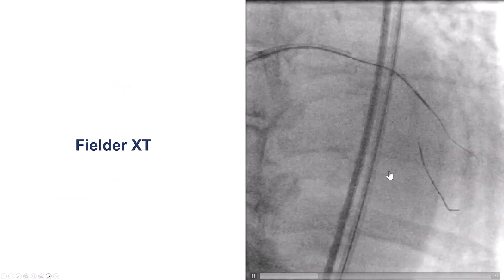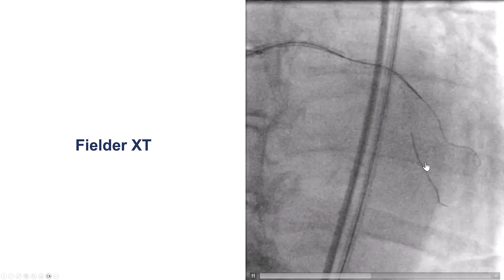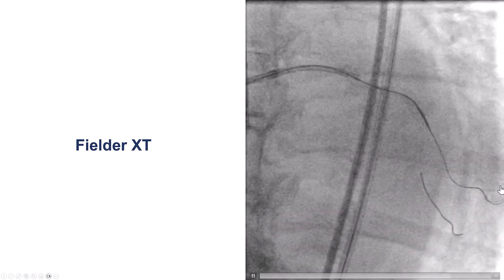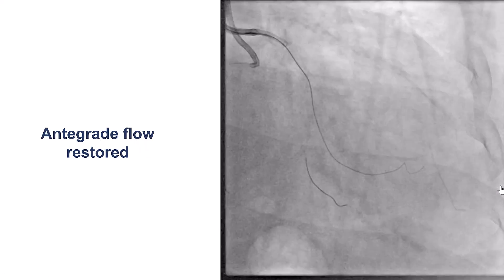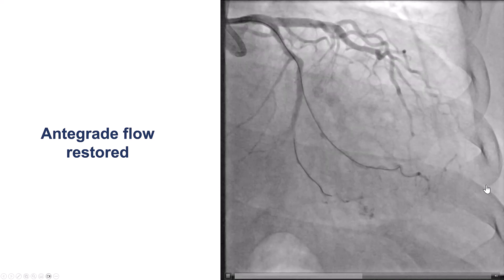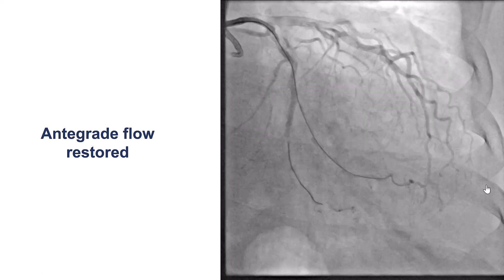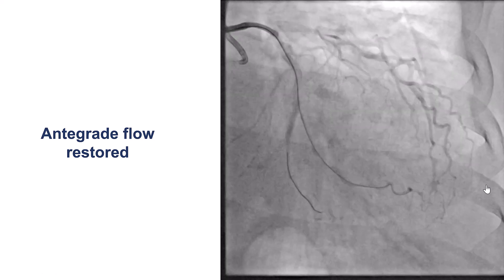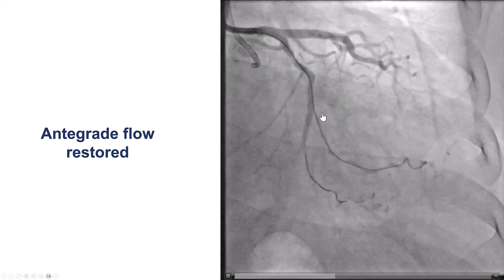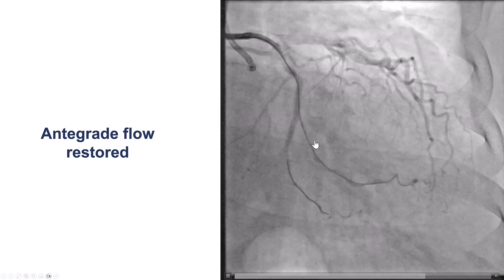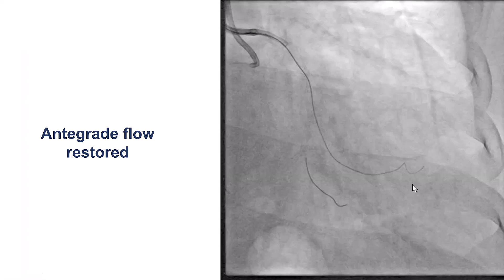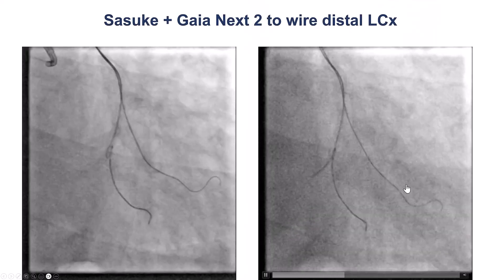We took a polymer-jacketed wire again — a Fielder XT guidewire — which created a knuckle and pushed it further down. After doing that, we were able to restore antegrade flow into the branch. Essentially, we performed the STAR technique: using the STAR, we were able to cross and restore antegrade flow.